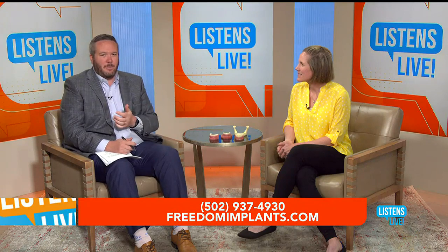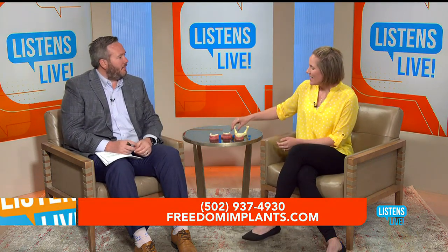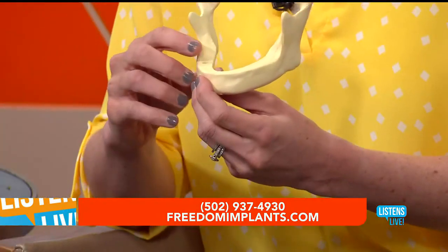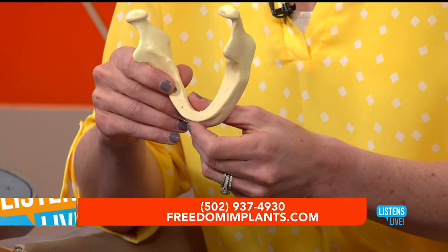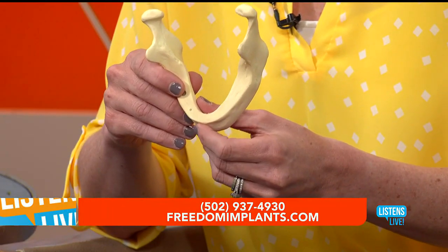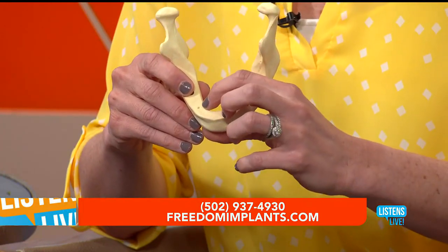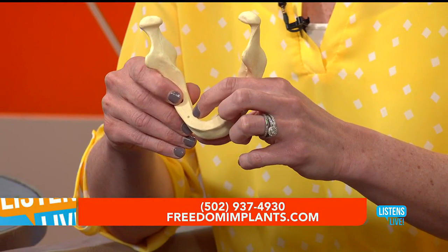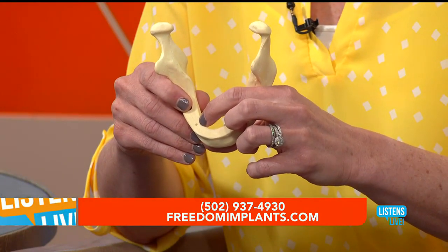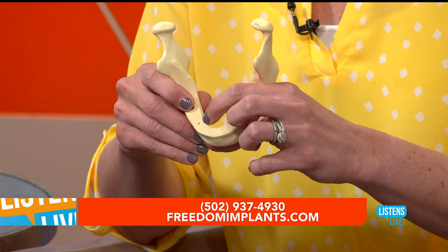I think a lot of people are sitting at home and going, okay, that sounds good. Can you show me what that means? And you have a model here that kind of helps better explain it. I think this speaks volumes as far as how minimally invasive it is, or when we say, if you weren't a candidate for the bigger surgical implants, they said you didn't have enough bone, why you're a candidate for the mini implant. So this little hole right here that I'm pointing to, it's hard to see because it is so small, that's the little pilot hole that I have to make to place an implant. So I don't have to have much bone, I just have to have some bone.